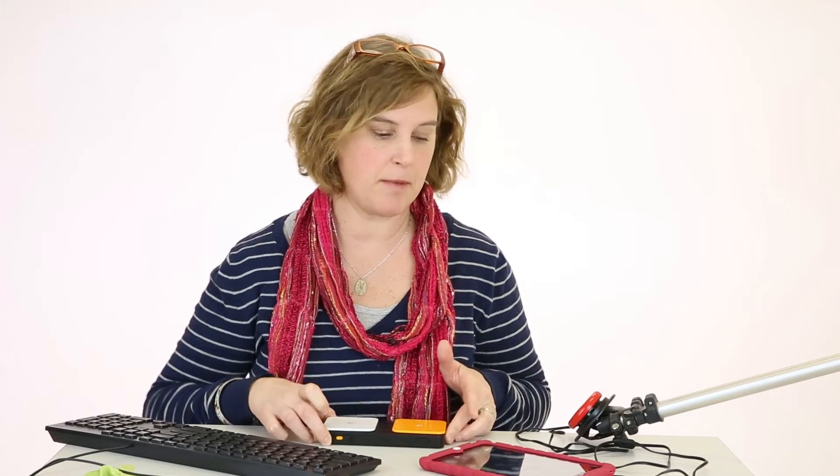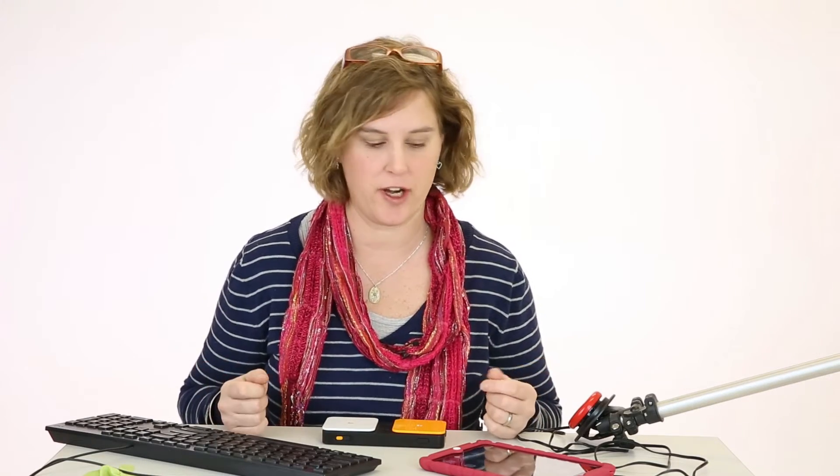Hi and welcome to eSpecial Needs. Today we're going to discuss some of the assistive technology that we offer. This one is called the Bluetooth. It's a wonderful switching device that can be paired using an iPad, an iPhone, PC, or a Mac device, even an Android.